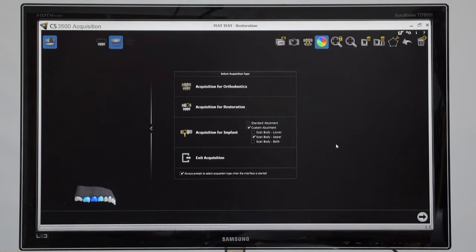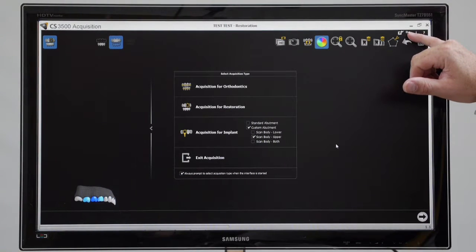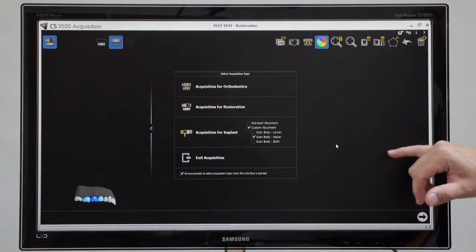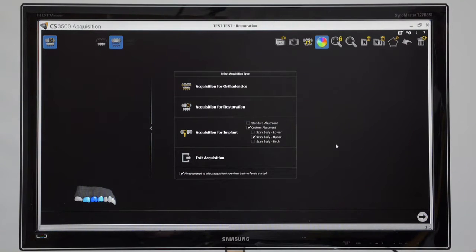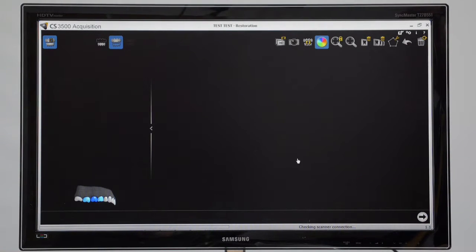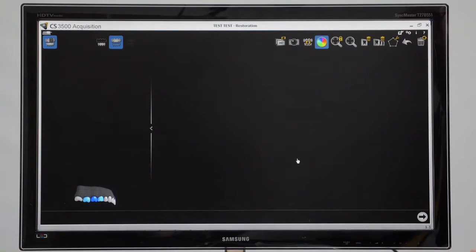In this tutorial, I'm going to bring your attention to these cog settings so that you can look at some of the settings you've got in the background to the acquisition software. First, click on a case and click on this cog here.